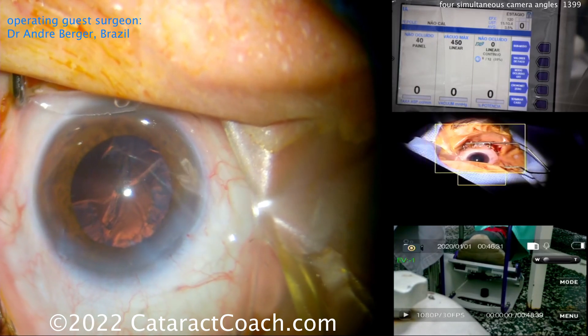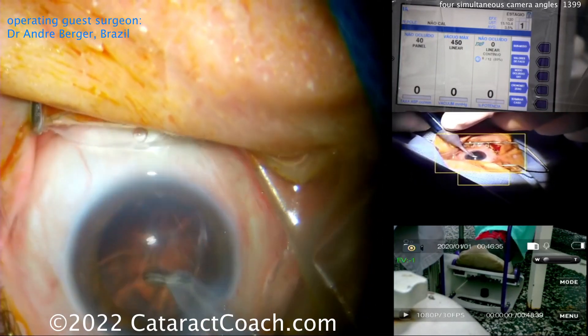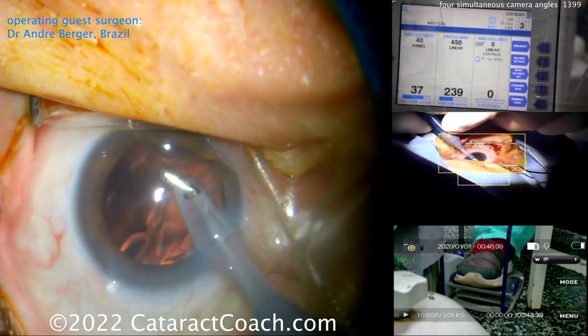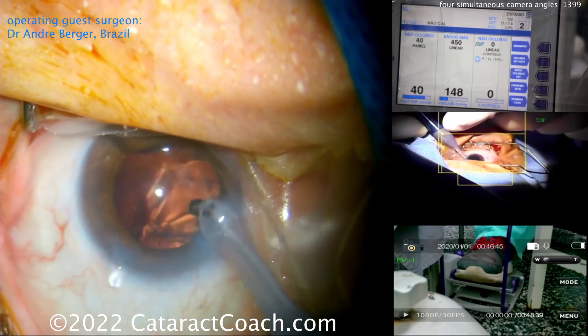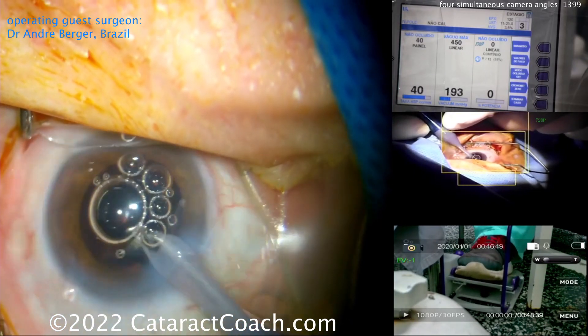Now he's got his I/A probe coming in. Look how he holds it — he's holding the I/A probe with a two-handed approach to give extra stability, cleaning up all that cortex. Very efficient surgery here, cleaning up very nicely.